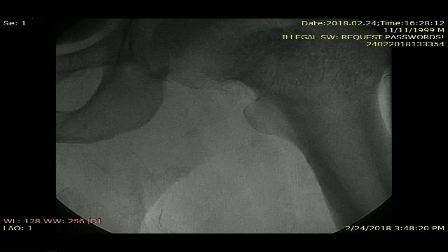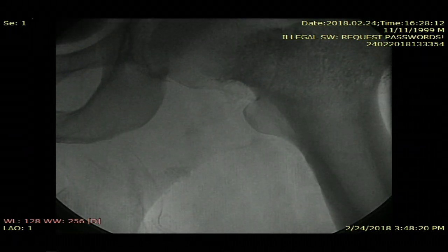So after this completed successfully, we were thinking about whether we should complete the PCI for the patient or stop at this point and reoperate again after some time. But we were courageous enough because the patient was hemodynamically stable and no problems happened after this point. So we re-entered the LAD again and did the PCI because he was non-STEMI, and we didn't want to let him wait. Maybe the problem would progress more in the LAD.